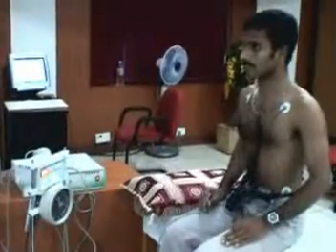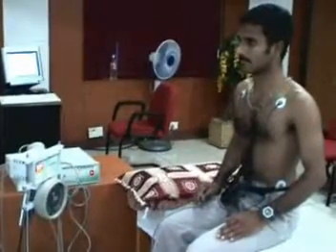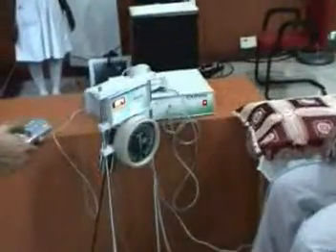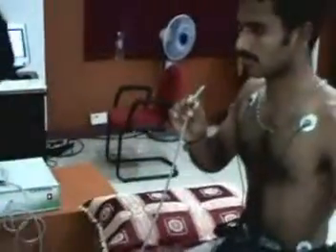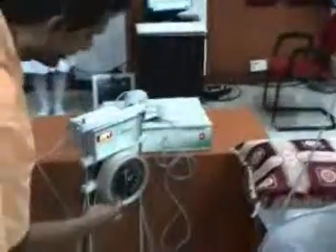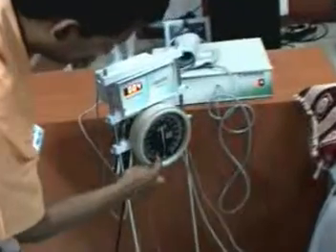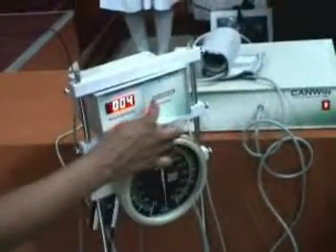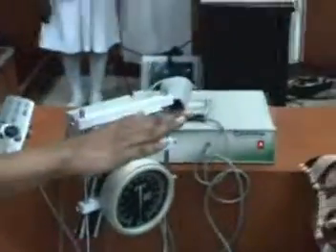So now we will go to the fourth test, which is the Valsalva maneuver. It is nothing but when the green light is on, you have to blow into this tube. And you see here, this is a panel here. And here you should maintain it at 40. When the red light goes off, you can relax. Now we'll perform the test. Just be ready.